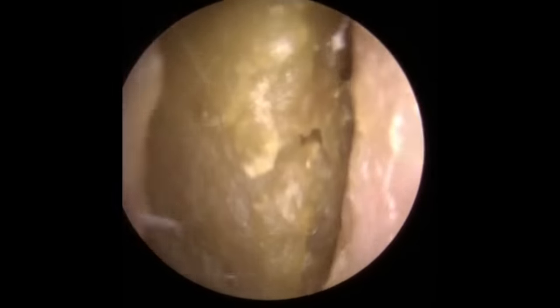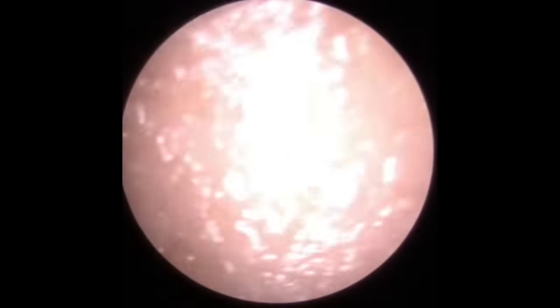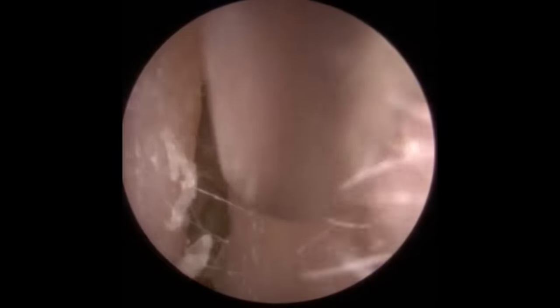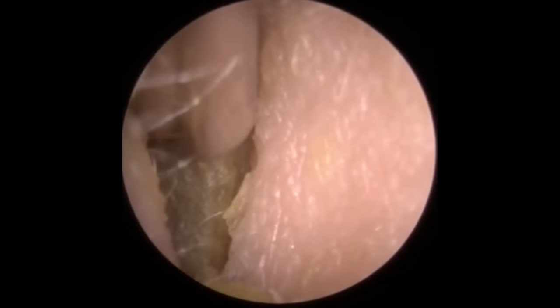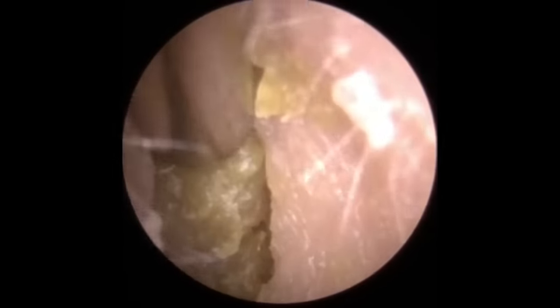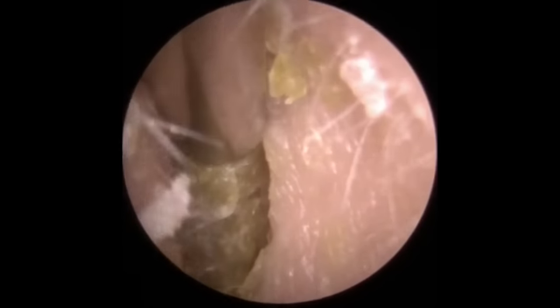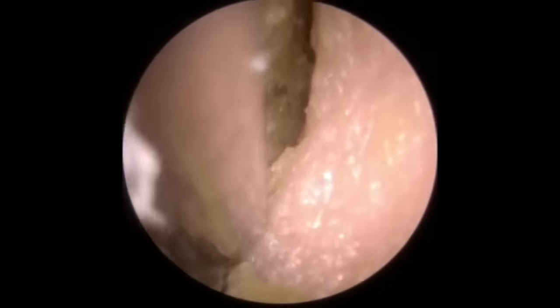Hi everybody, this is Rhys Barber from Audiology Associates. Thank you very much for watching the earwax removal video today. This lady has come through with very blocked up ears on both sides — she's really been struggling with her hearing. A little bit of discomfort as well, caused by the wax pressing on the canal walls, but no other signs or symptoms apart from that.